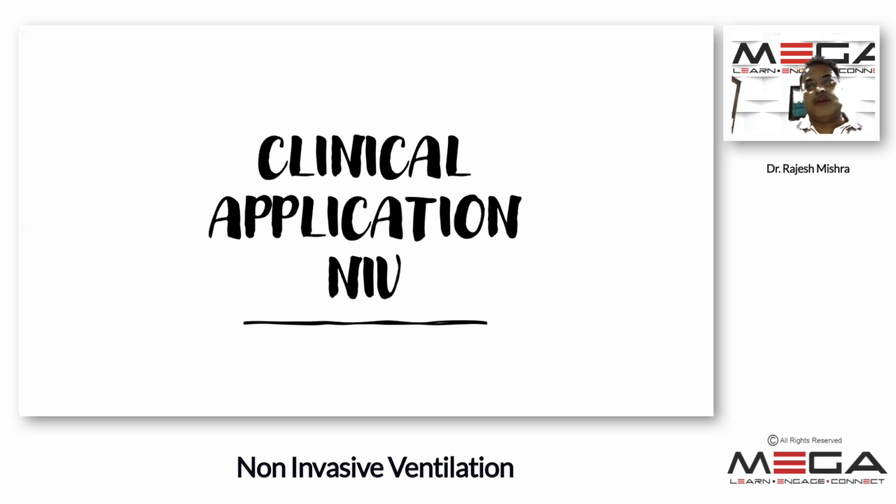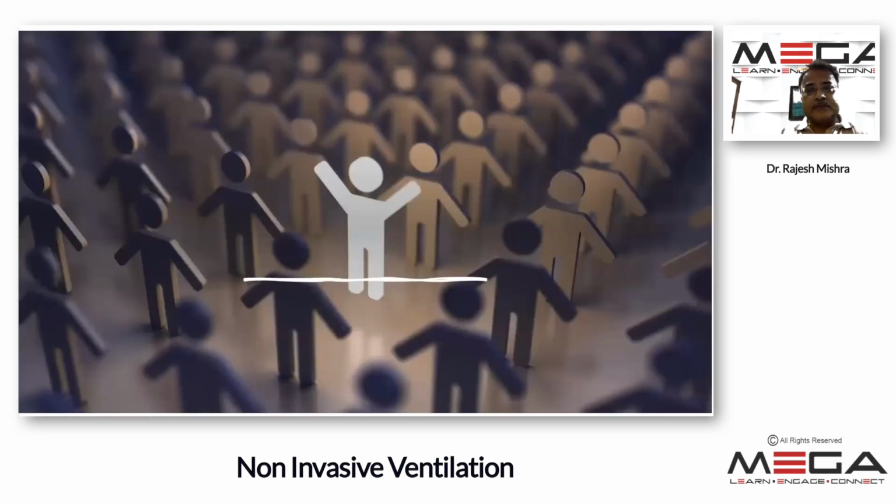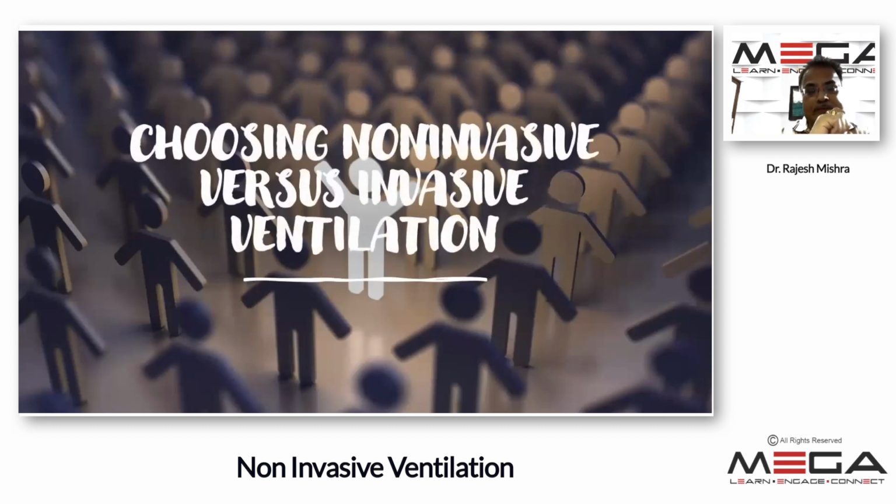Now, clinical application for non-invasive ventilation. You have to choose your patient properly. NIV, even in the most grade 1 indications, that is acute exacerbation of COPD or acute LVF, or in any case, whenever you choose your patient, every patient behaves differently. Though you may be giving the best trial, it is very important when you are using NIV for the initial period of time that you monitor this patient and see that whatever settings you are giving, the patient tolerates them, or the patient needs more NIV support or increased monitoring.